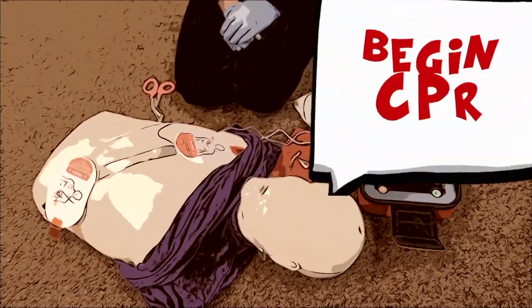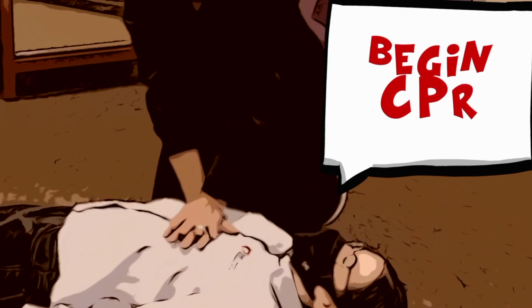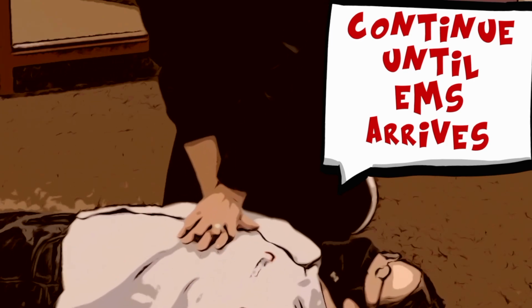It is safe to touch the patient. Begin CPR. Continue until EMS arrives.